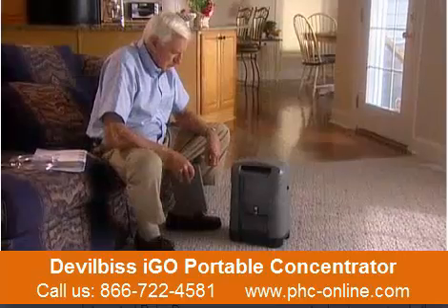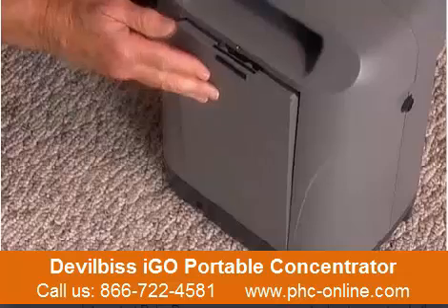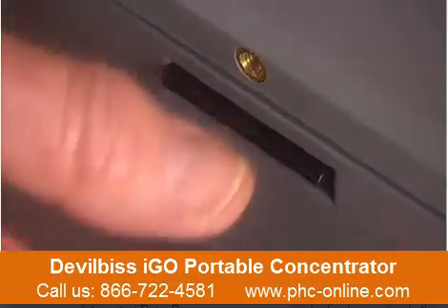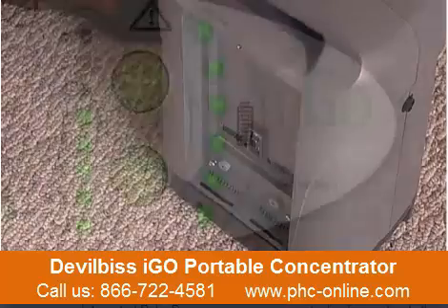To install the battery, insert the battery tabs into the slots in the battery bay and push the battery until it is secure and flush with the back of the system. To remove the battery, push down on the latch. The battery will tilt so you can easily grasp it.